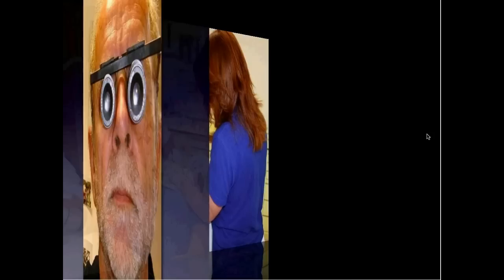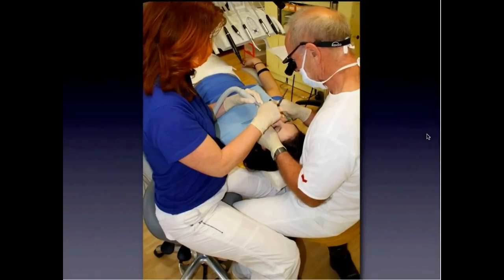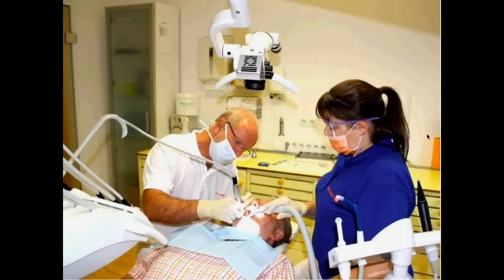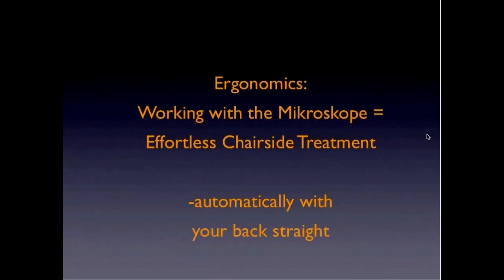And as you can see, you want to have a direct sight on the area you're working in, also with loupes on your head. Or even in this exciting position, you have to bend too much forwards to see what you're doing. Or when I'm doing some more coarse work or just polishing, I just push the microscope up and it's there all the time ahead of my face. I just have to fetch it and I can adjust it within 1 or 2 seconds.